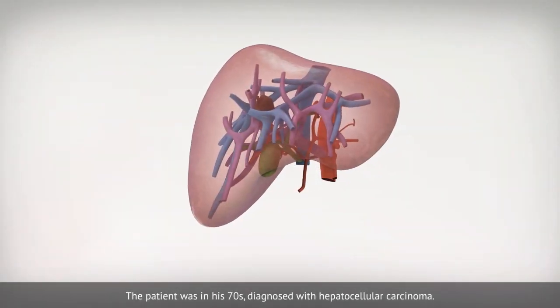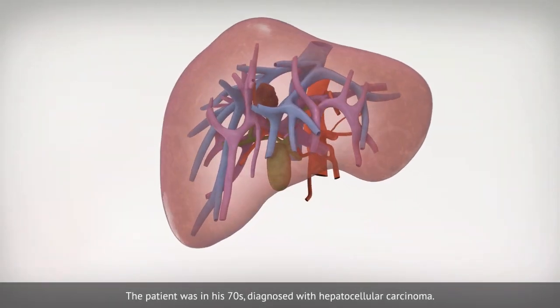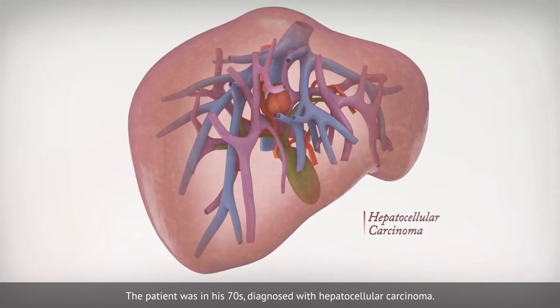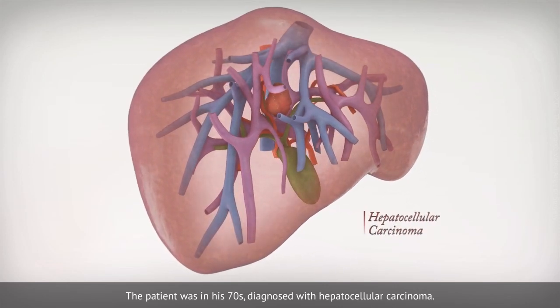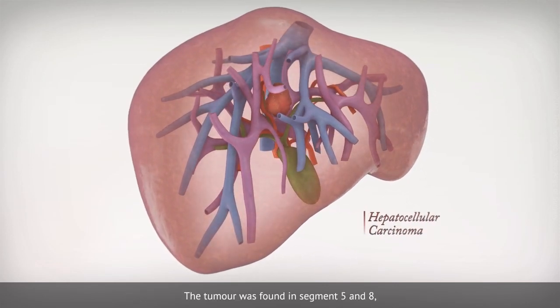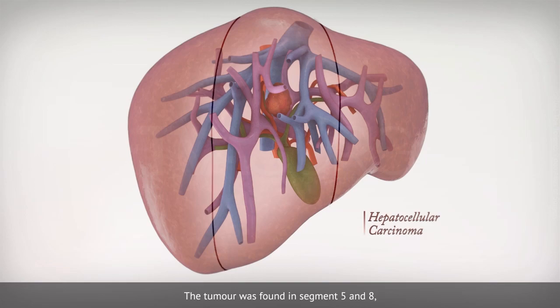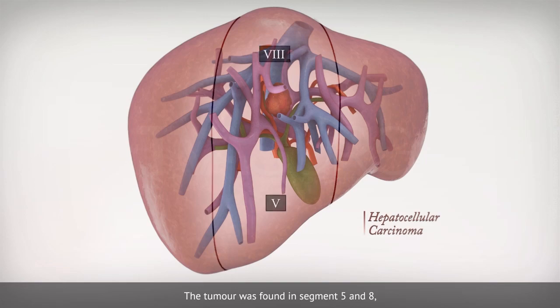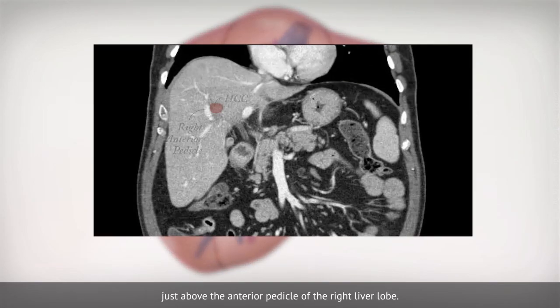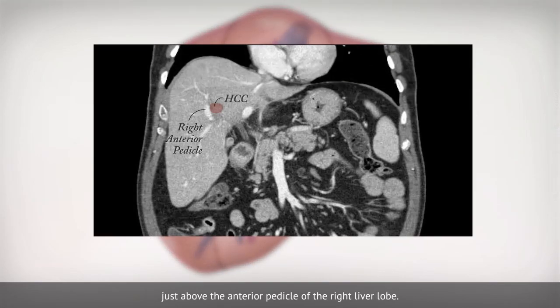The patient was in his 70s, diagnosed with hepatocellular carcinoma. The tumor was found in segment 5 and 8, just above the anterior pedicle of the right liver lobe.